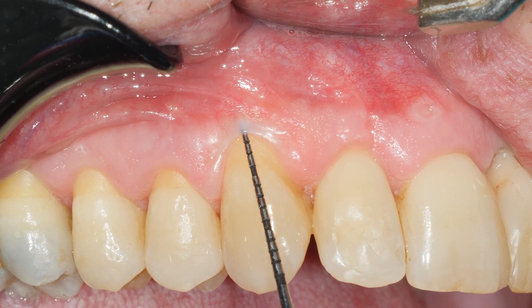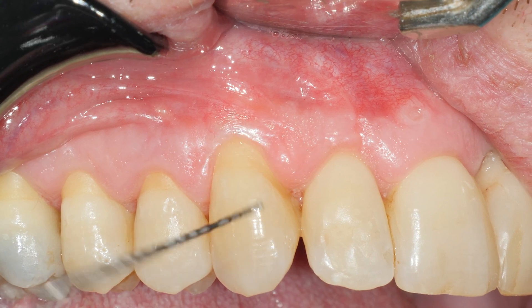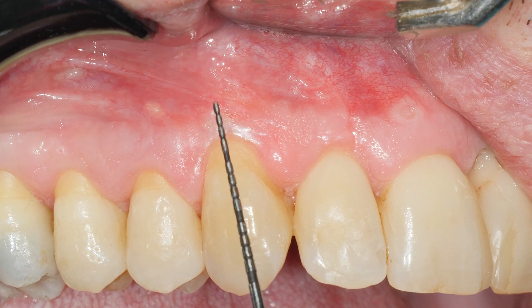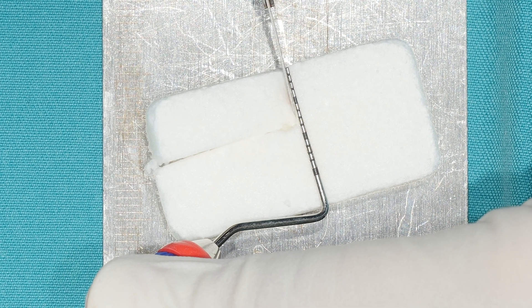The most important thing is to modify the soft tissue phenotype. You can see the tissue is thin — we probably have one to two millimeters of keratinous mucosa. There are two sizes of this material; we're using the bigger one.